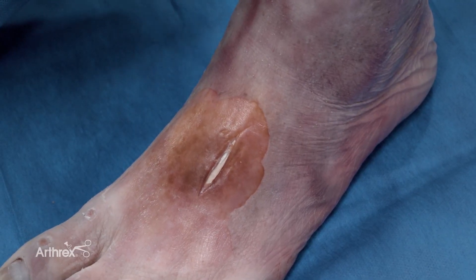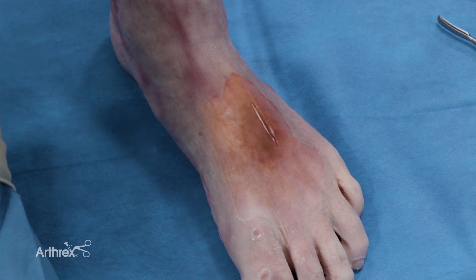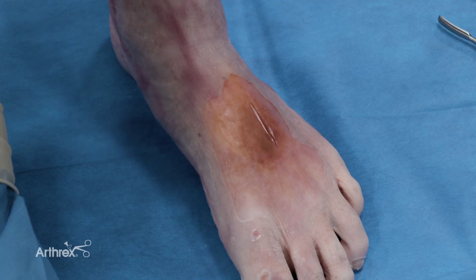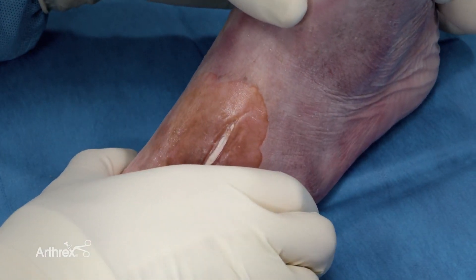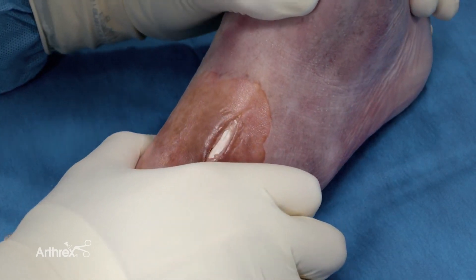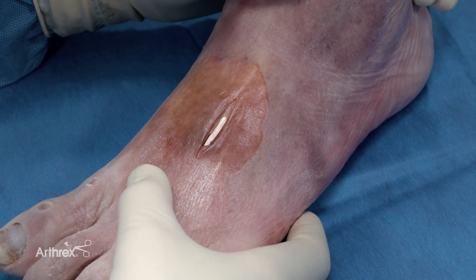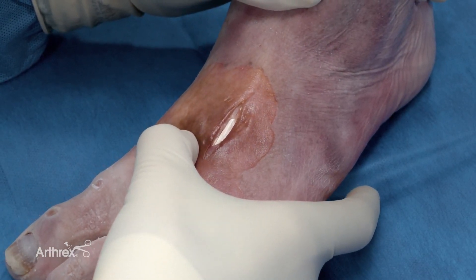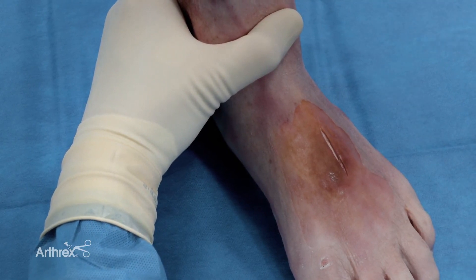Prior to going to the operating room, the patient has had an MRI and or a CT scan. If there is obvious instability, we will proceed to the operating room knowing that we're going to fix the Lisfranc ligament region. If the patient has a questionable injury but requires some stress testing under anesthesia, prior to making any incisions, the patient will be stressed under fluoroscopic imaging. Typically that is a rotational and an abduction or adduction force to see if there is any instability. Another way to do it, which I do in clinic because it's less painful, is to get a thumb in between the first and second rays more proximally and push in between here to see if you get any gapping at the Lisfranc.